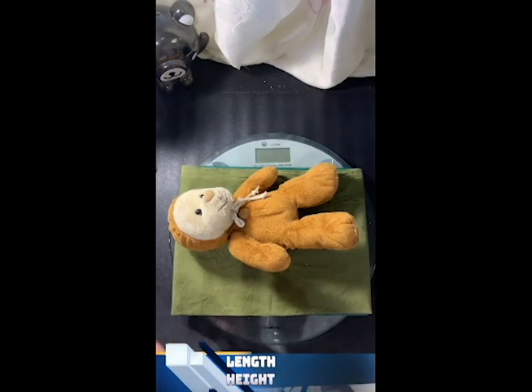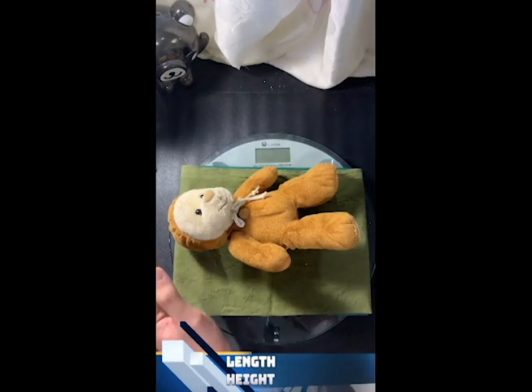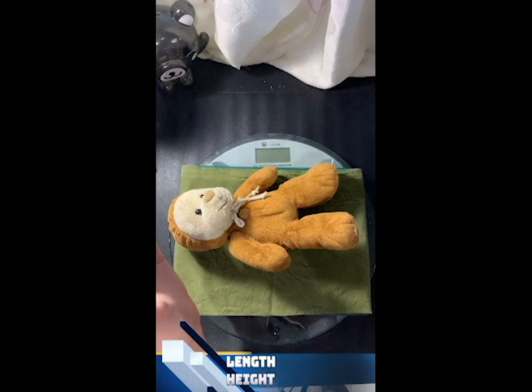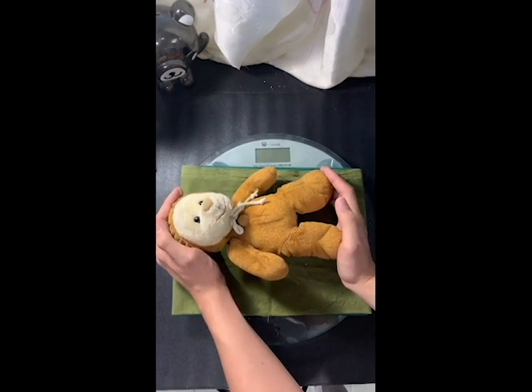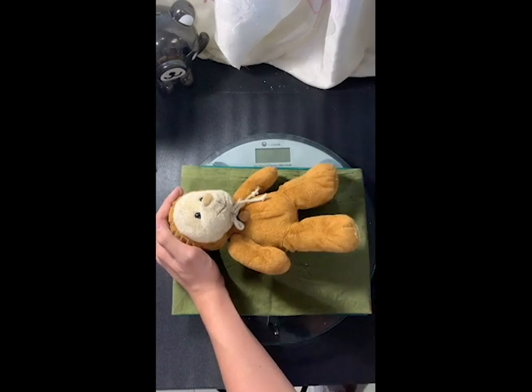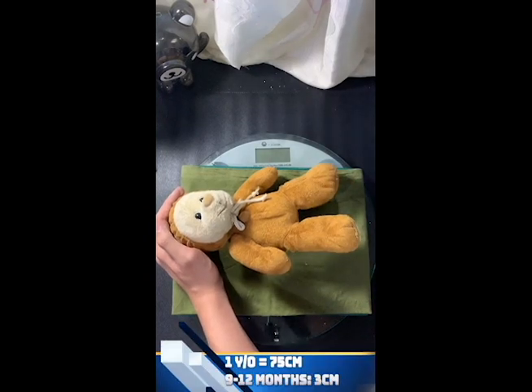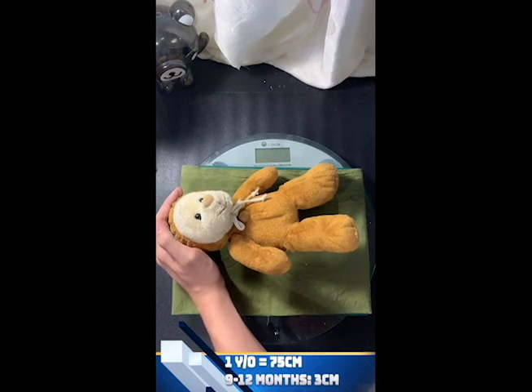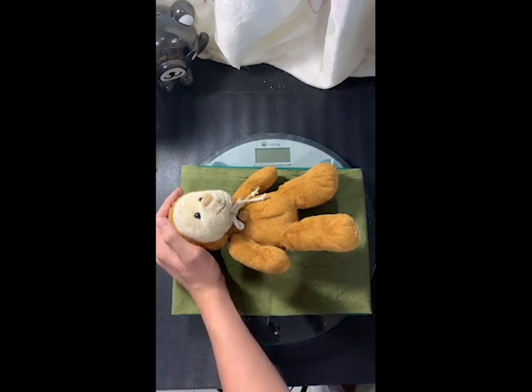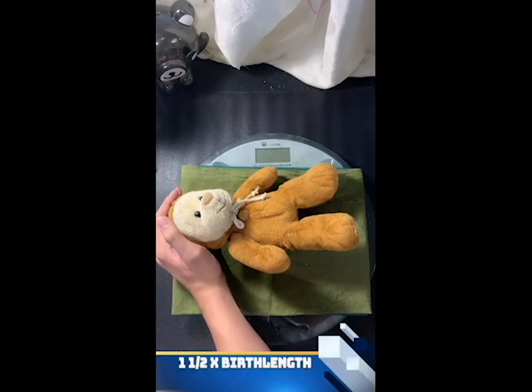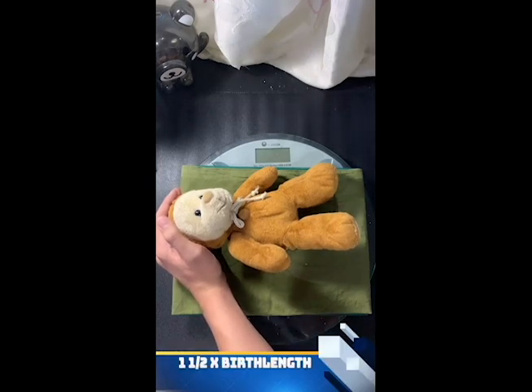For the length, using the infantometer for a one-year-old, which has a steady part on the head and the movable part on the foot. The usual length for a one-year-old is 75 centimeters, and the average length gain for 9 to 12 months is 3 centimeters. We could also use the calculation for height, which is 1½ times the birth length.